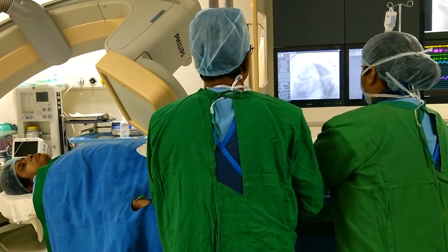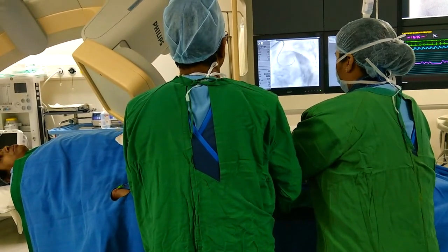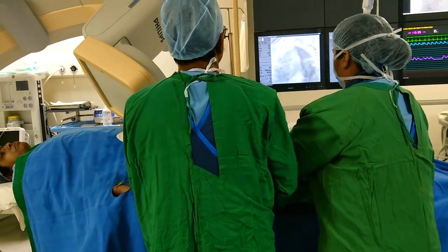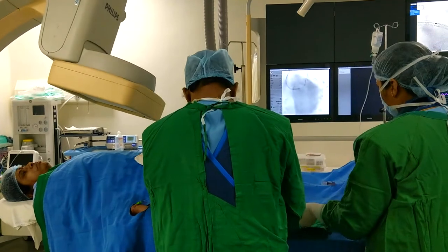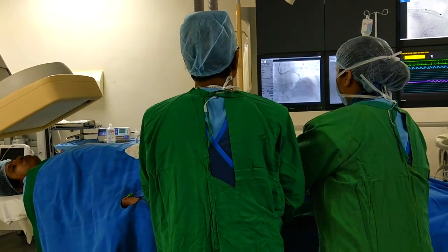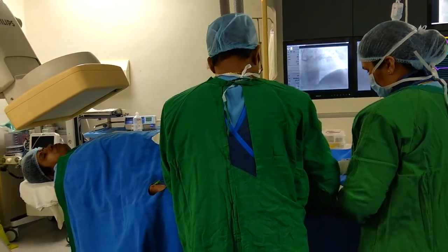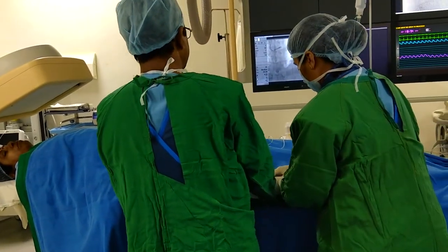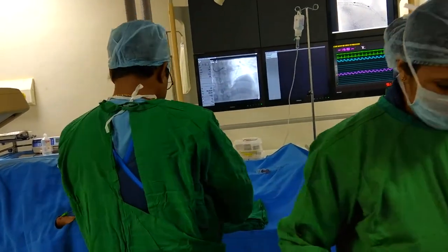In this patient, I am engaging the guide catheter to the left coronary system at the level of the left main. The left main is engaged with an EBU 6 French catheter through the right radial artery. On the right side we observe the monitor with heart rate, oxygen saturation, and ECG monitoring. Now the left coronary artery is engaged with the guide catheter.